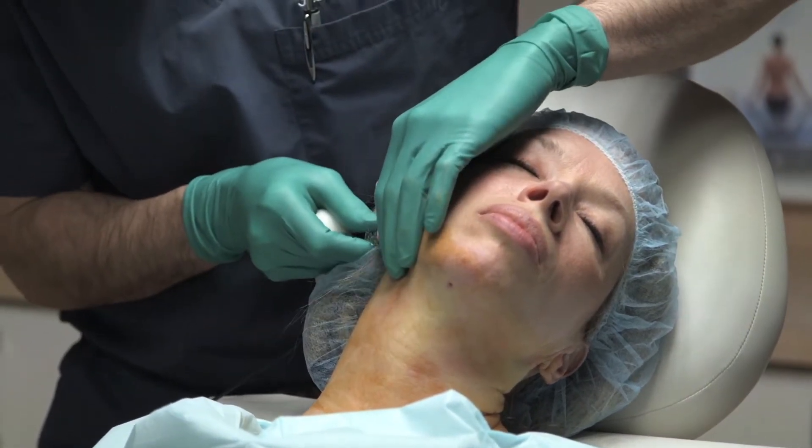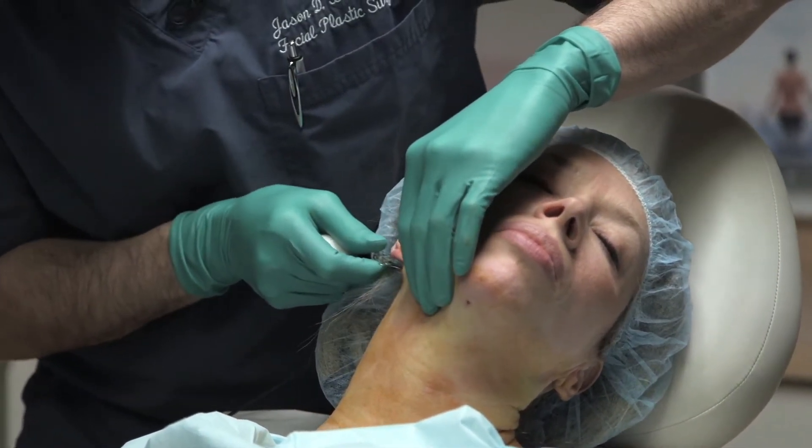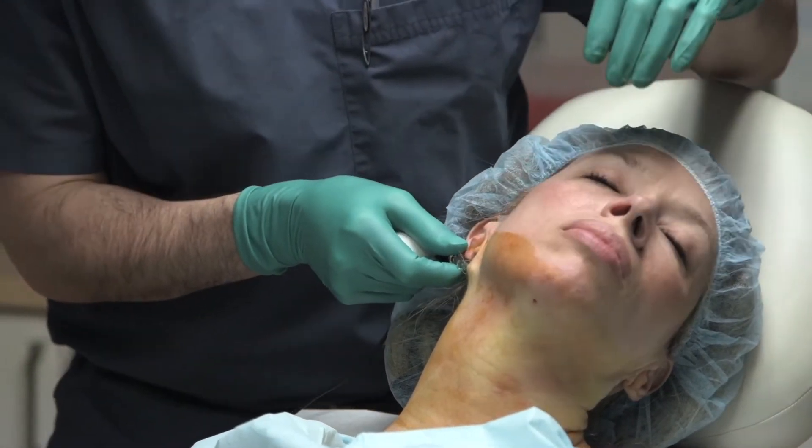Next, the RF element is then placed into the cannula and inserted into the lateral port in the neck.